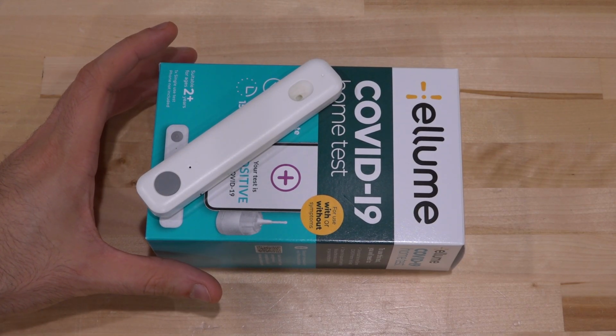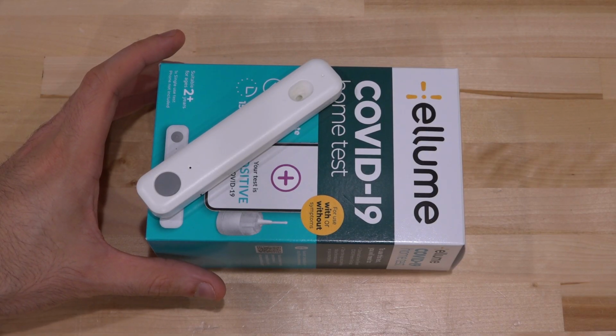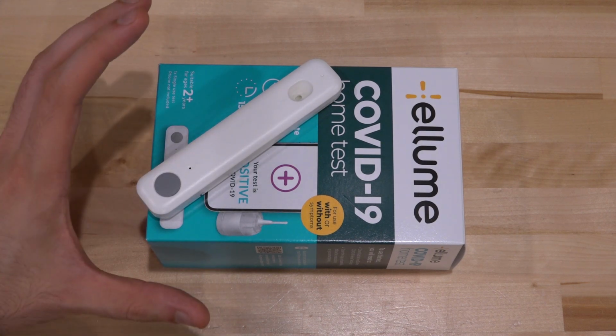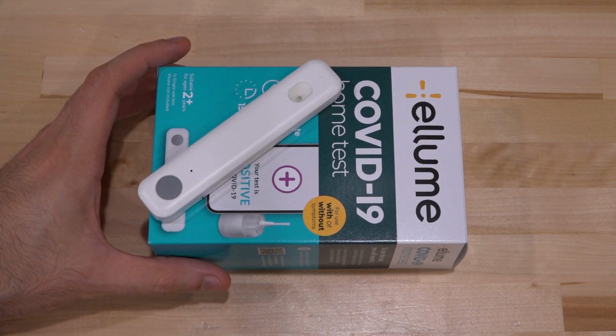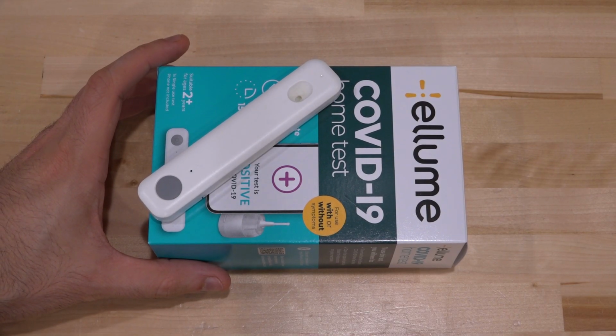These are antigen-based ones. In a PCR test, you have this DNA replication process done through a very careful thermocycle and then use your fluorescence to read it. Now, these antigen-based ones are protein sensitivities and they essentially have a dye that attaches and then some lines appear, kind of similar to a pregnancy test.